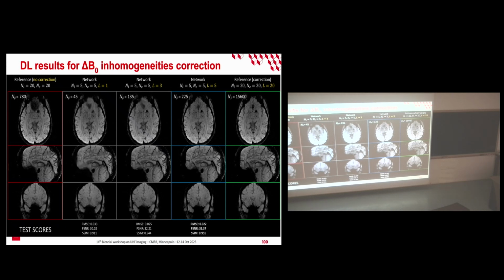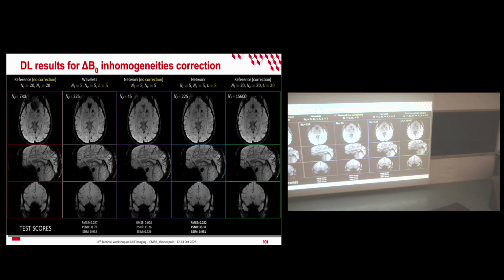It was important because if I use the neural network, the NCPDNet, but just with the classical data consistency term, what I obtain in this area is just a blurring. So it's completely non-consistent with the original reconstructions. So really, writing and involving the right forward model was critical to save time and to be accurate as well. So that's what we did to handle that.